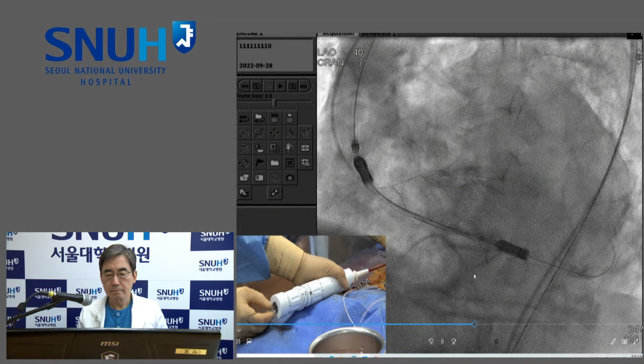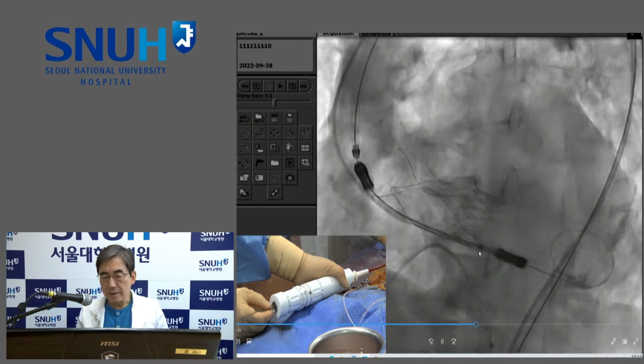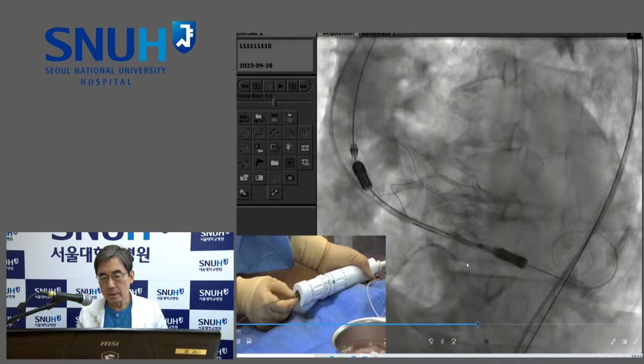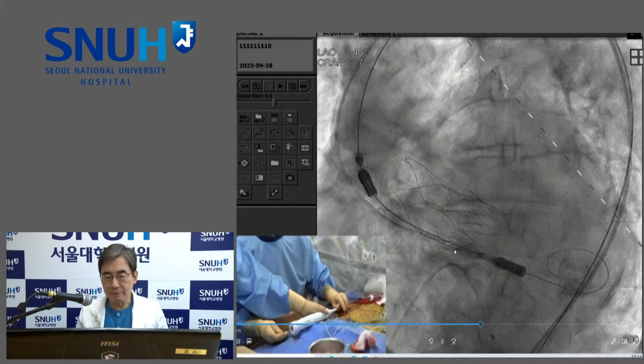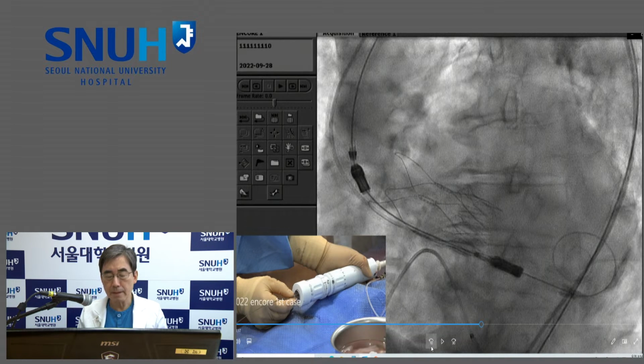So what is the last point when you can adjust the position prior to that last deployment? Yeah, the same. The marker is at the annulus level. So we have to be very cautious not to move the valve. Can you change implantation depth in this stage? A little bit, but if the upper crown is deployed and arch is deployed, the system is nearly fixed. Of course, if we push a little bit deeper, it may change, but already upper crown and arch is deployed, thus there is a minimal movement of the whole system.